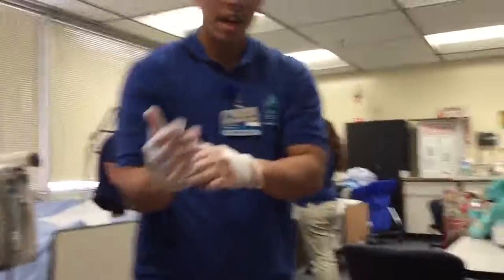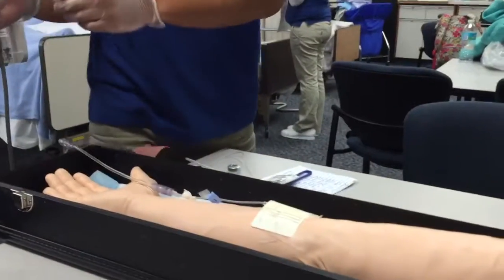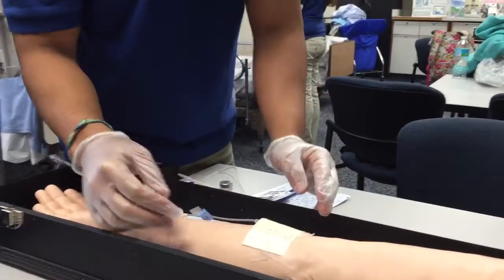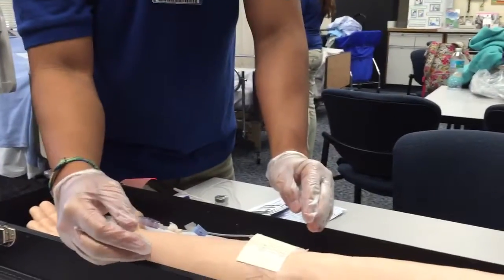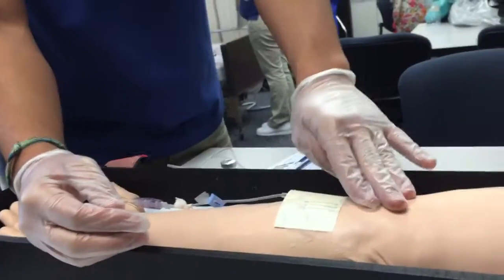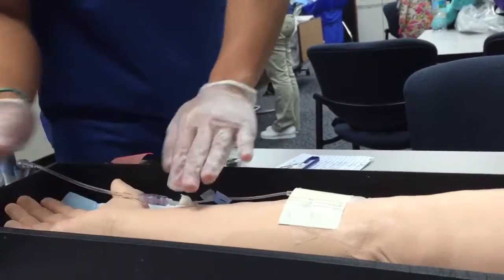So, this is his IV. I'm gonna check the dates on the lines, and they look good. The medication is still dripping and running. The clamps are open. That looks good. I'm gonna assess for patency, and it's still running. Everything looks good. No phlebitis, no edema, no pain or tenderness in the area. It's not warm or anything. So this is unclamped. These are unclamped.